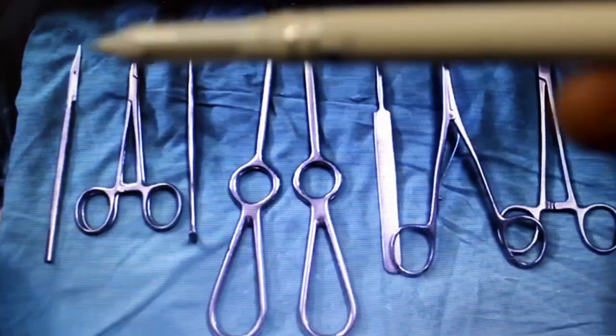And also, before starting tracheostomy, you should be ready with a tracheostomy tube. This is a Portex tracheostomy tube with an obturator and a cuff. You should check the integrity of the cuff before starting tracheostomy, and if needed, it should be ready with the strappings.